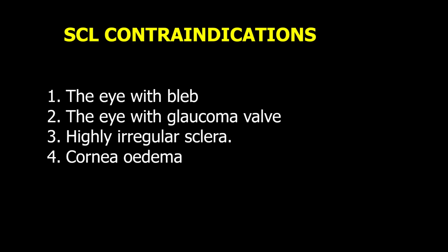So that might affect corneal edema. And that is why it's always recommended to do specular microscopy every 6 months in the course of your scleral contact lens management for this patient, to see the level of endothelial cells. Are they depreciating? Are they increasing? And also check the corneal thickness from time to time. Studies have shown that scleral contact lenses have the tendency to cause corneal edema. So that's why you have to keep an eye on this patient and be sure that everything is going on well in the course of your management.